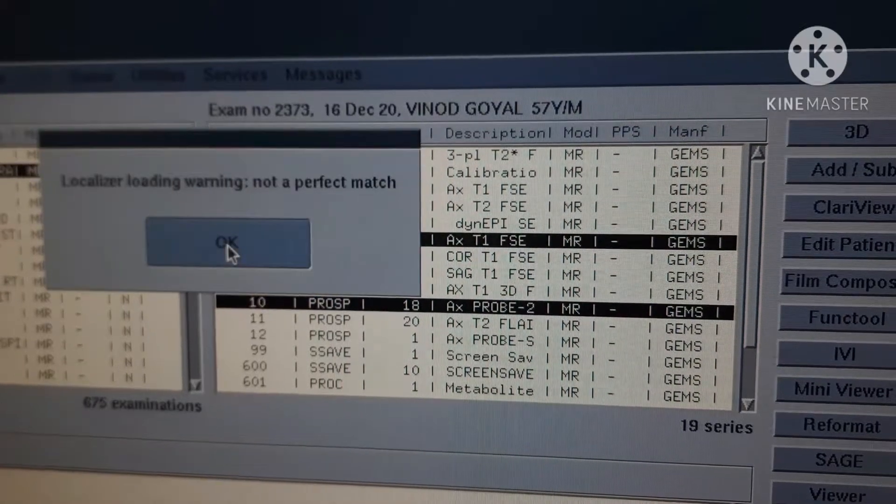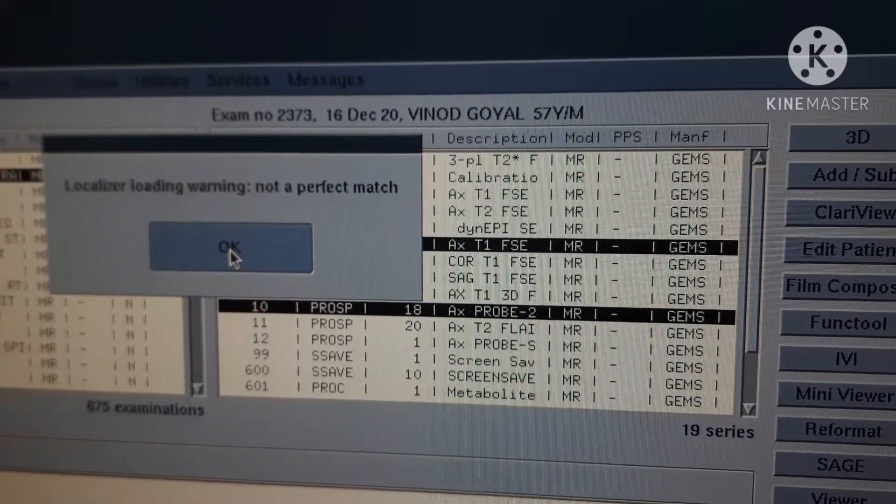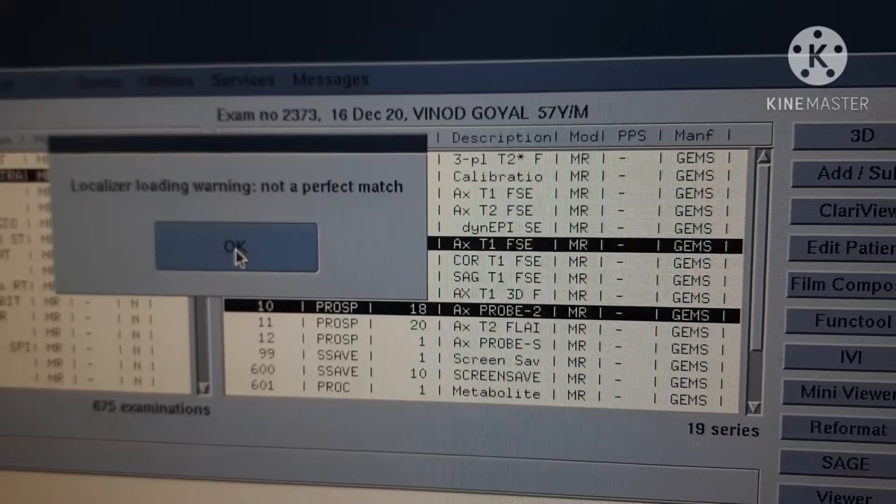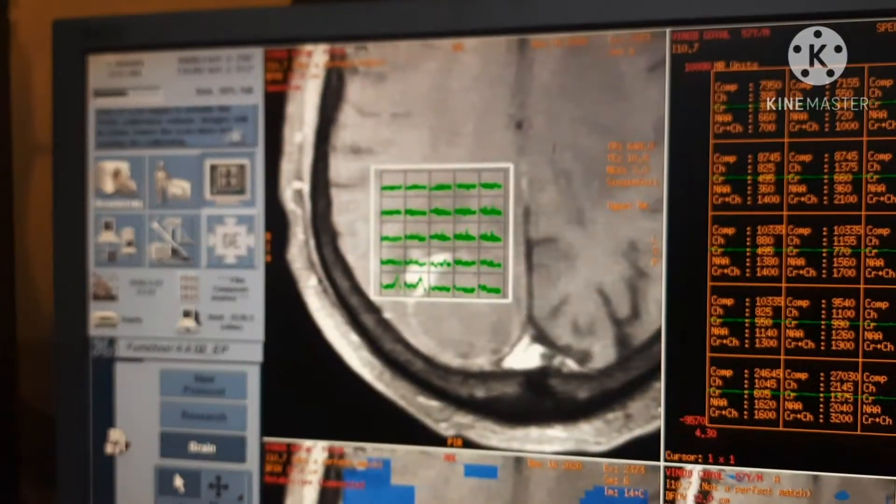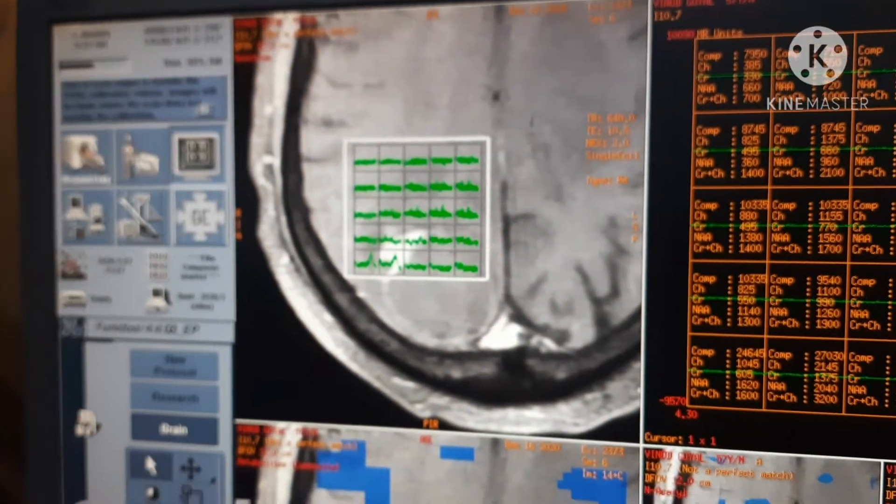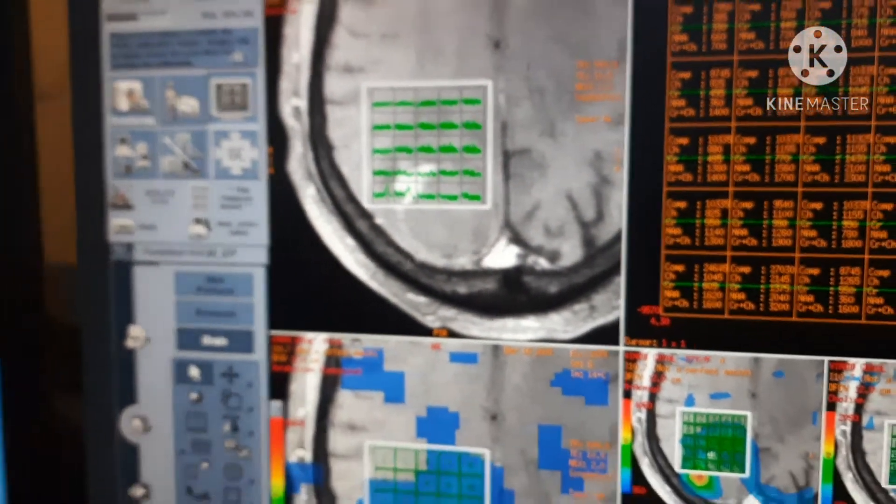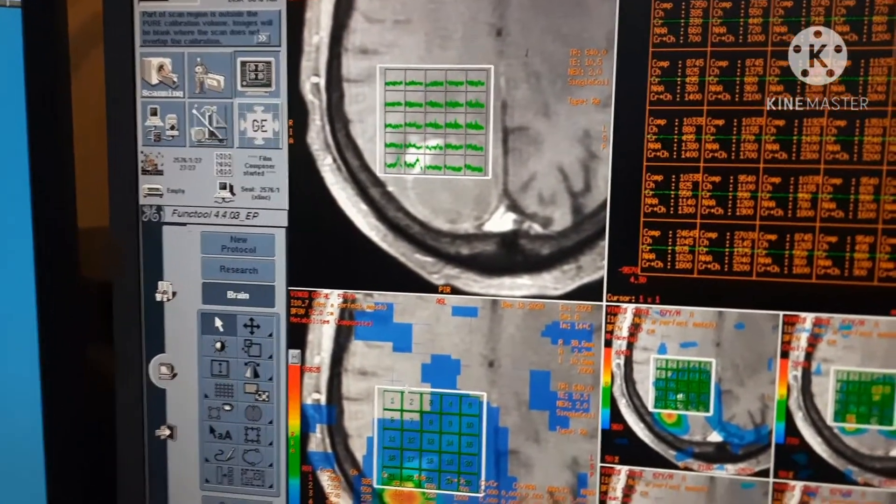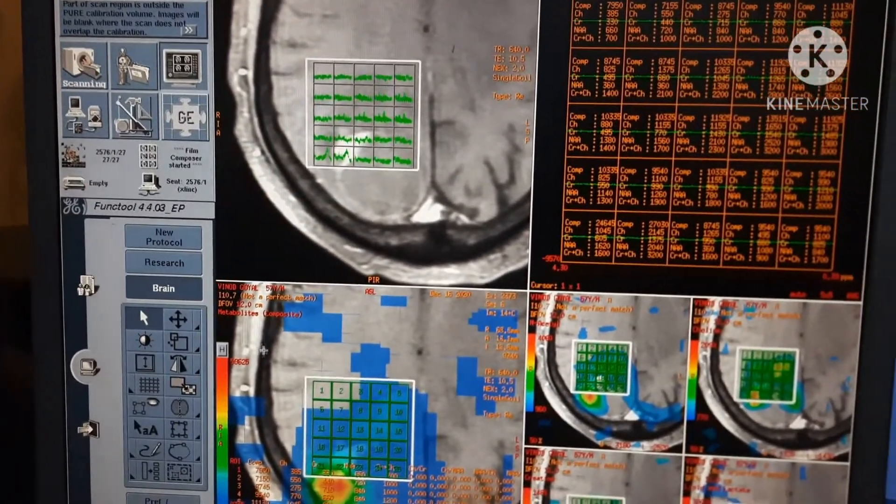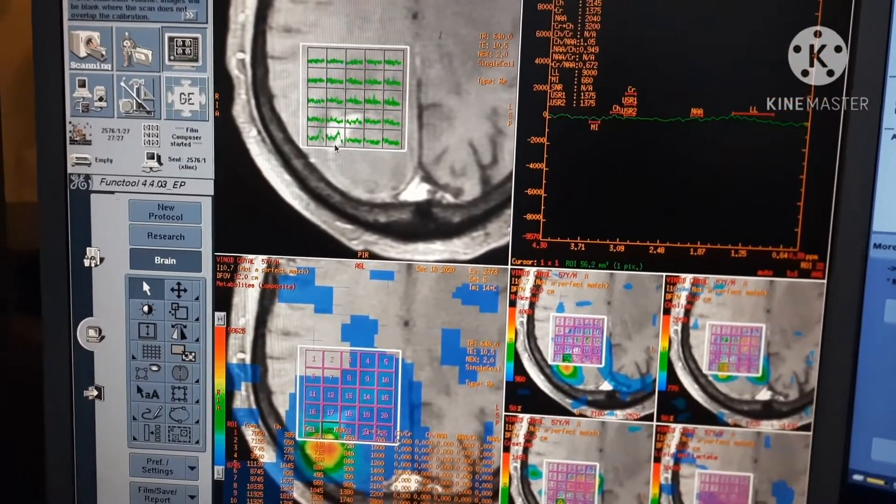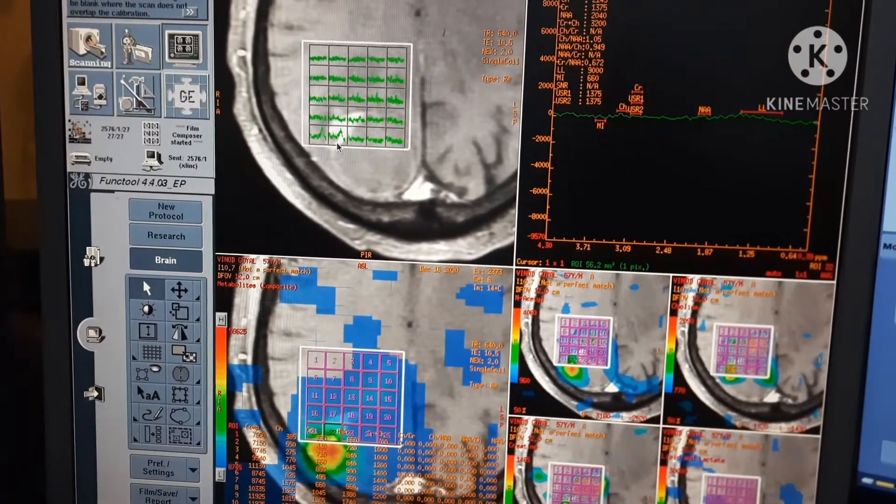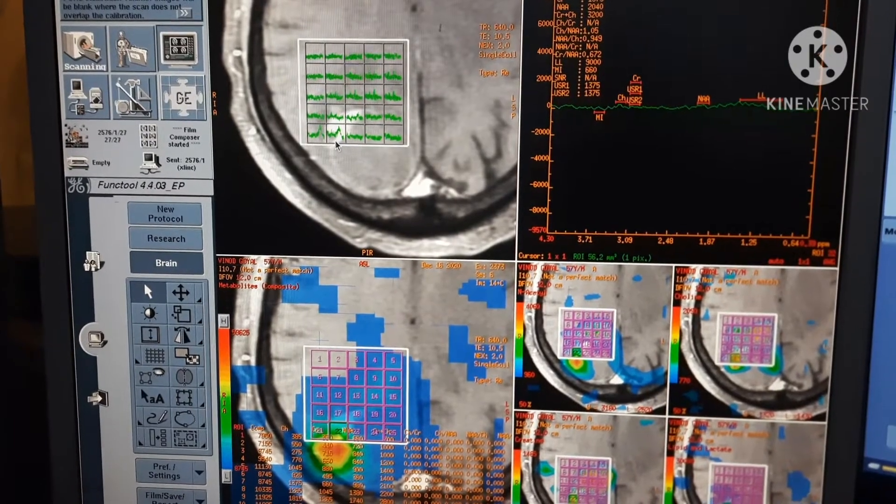We have selected post contrast as well as multi-voxel spectro. You can see we have to load it on MRS. Alright, you can select voxel as per your choice.